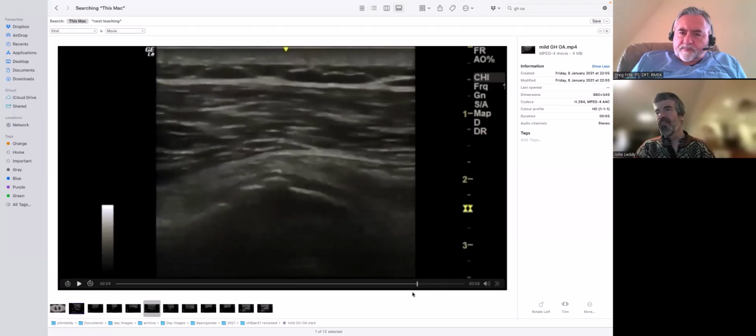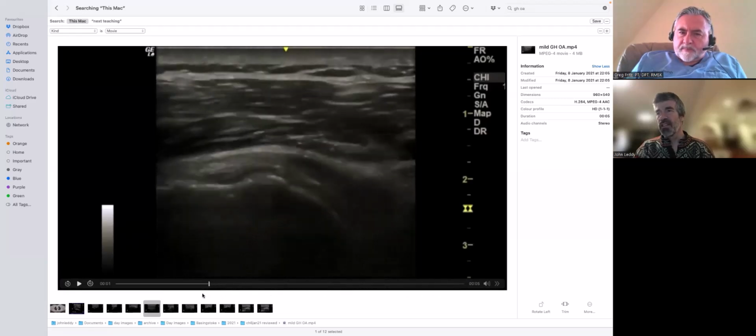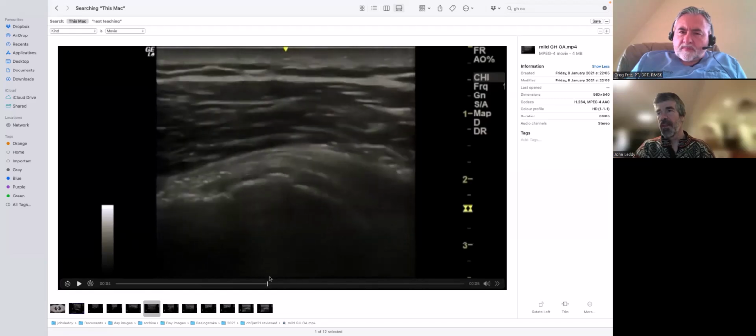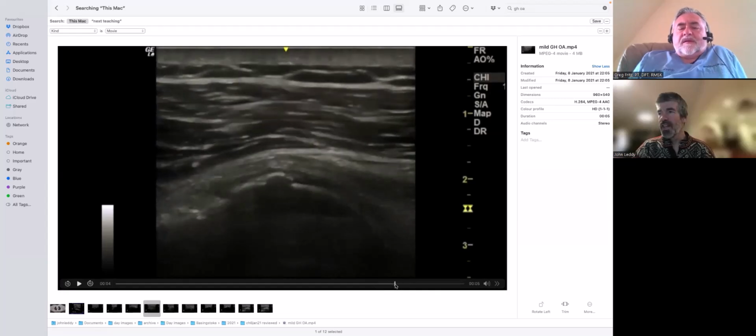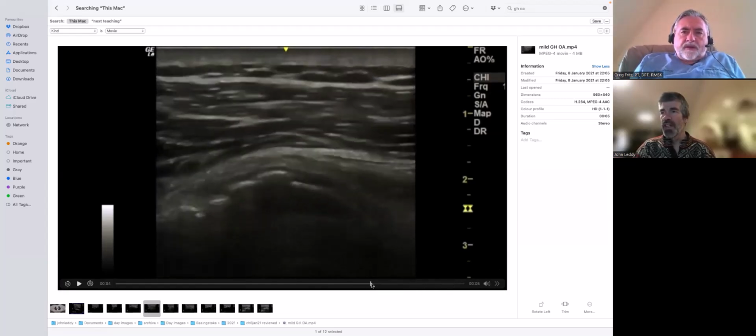Even this is very, very subtle arthritis in the shoulder. You're pointing to that little white area here. Yeah, just a little. The dark area to the right of that, yeah, that can't be articular. No, the articular margin is all this bit to the left here, or left on my screen. Yeah, this will be the articular margin, and that will be off towards the insertional zone. Or just below the insertional zone in this case.